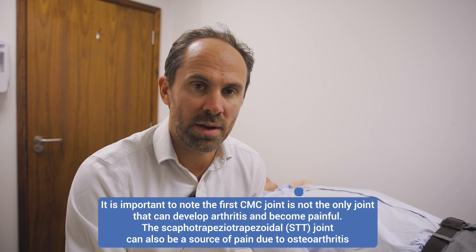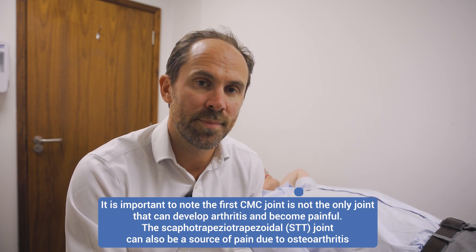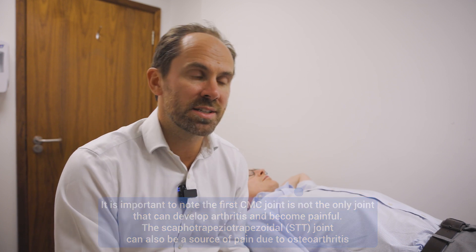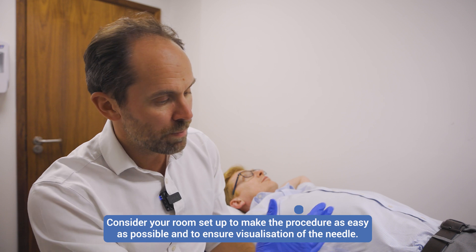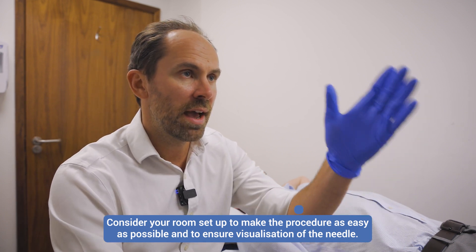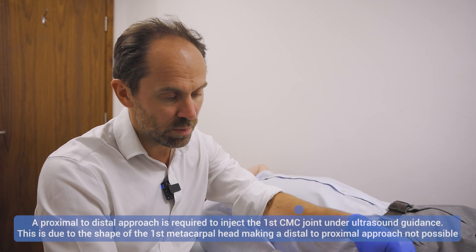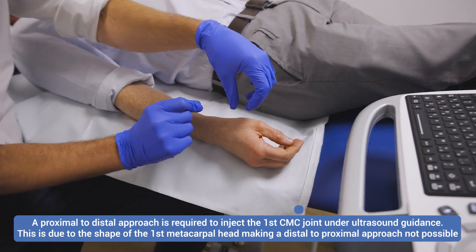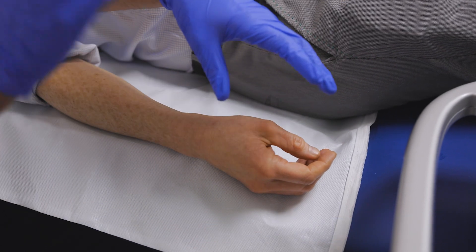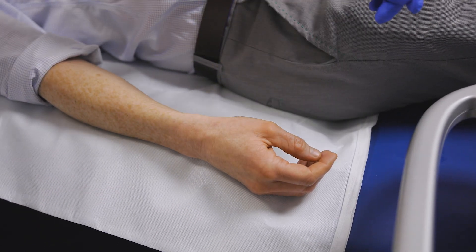I think the setup is really important to get right for this and does make the injection itself a lot easier. I would suggest that you get the setup of the room correct. I'm sitting on a stool, the patient is supine with the arm down by the side, and I'm going to be facing the ultrasound machine. That means when I'm holding the probe and trying to line up the middle of the needle with the middle of the probe, I can see the image in front of me, which makes things a lot easier.